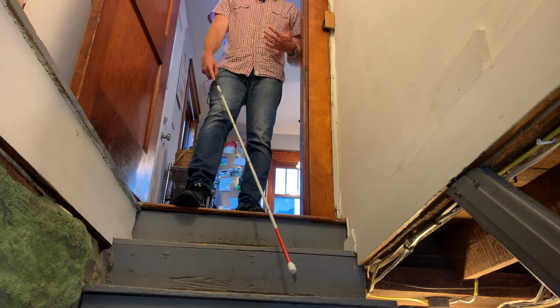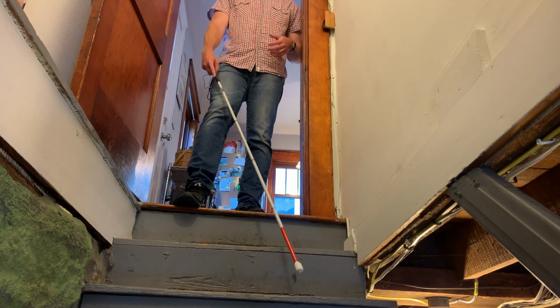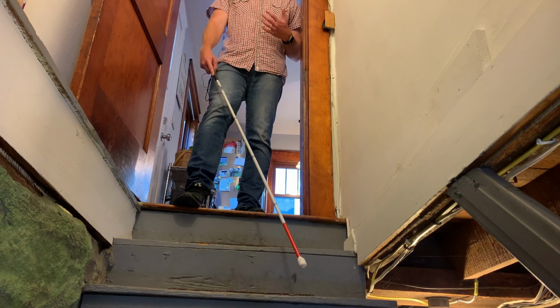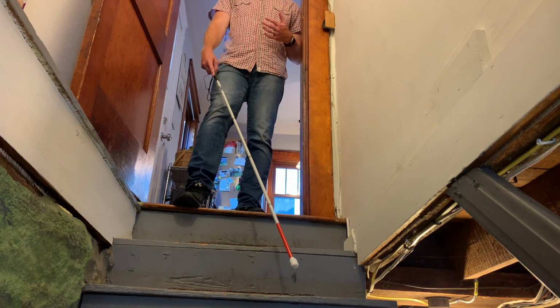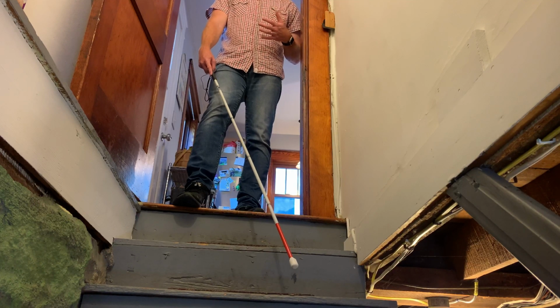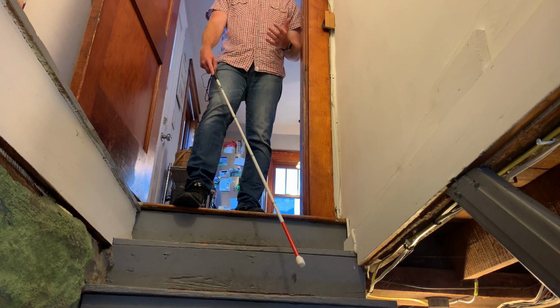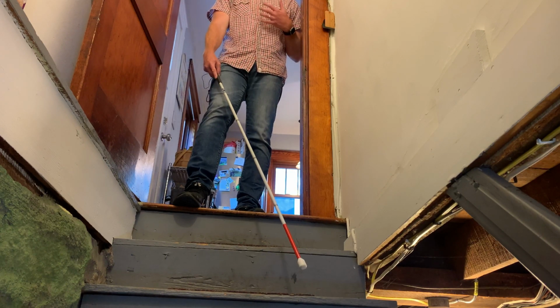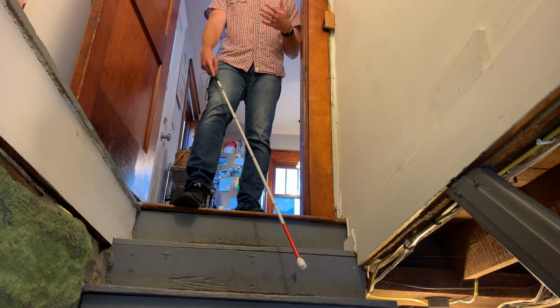All right, so now for step number 6, once you're in diagonal cane technique and your cane tip's hovering over the edge of that first or second stair, you can start descending down the stairs. And to do that, you're going to just step down like you normally would down a set of stairs, so 1 foot at a time. And while you're doing that, you're going to keep the cane in the same position, and it's going to keep hovering over each step a few inches.